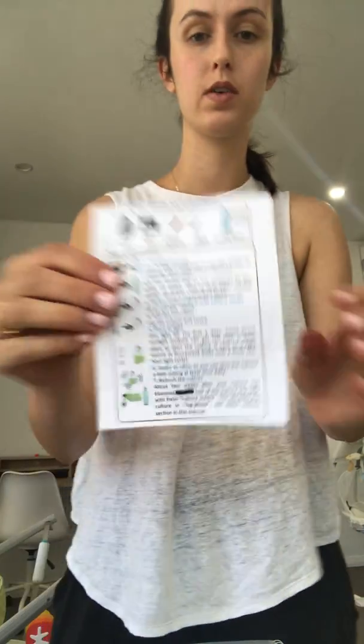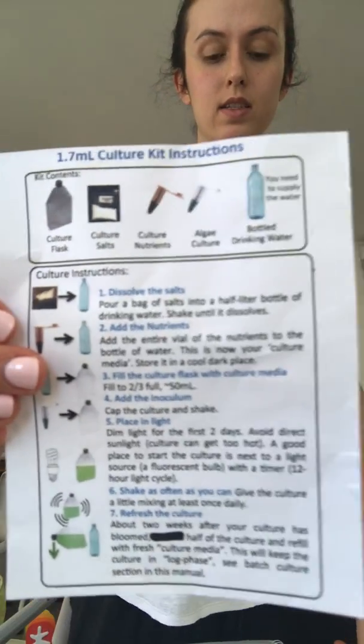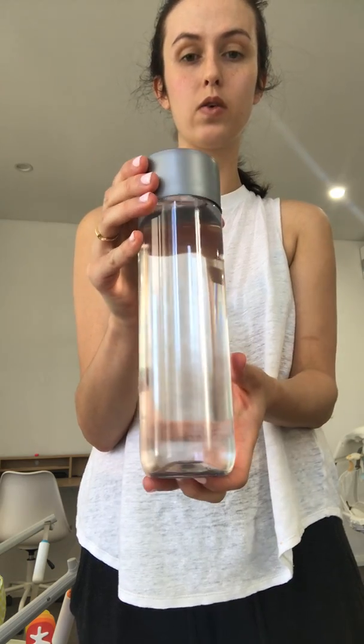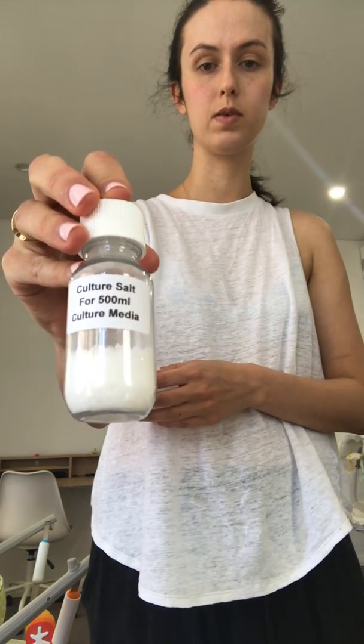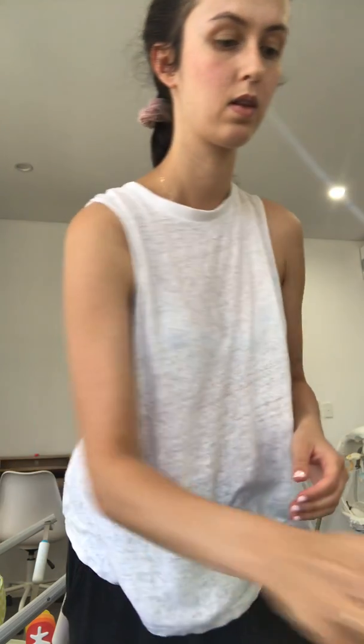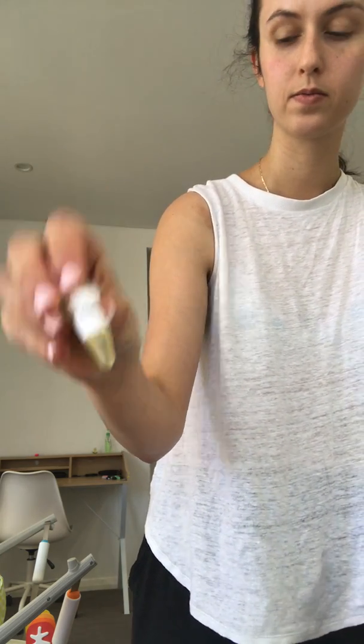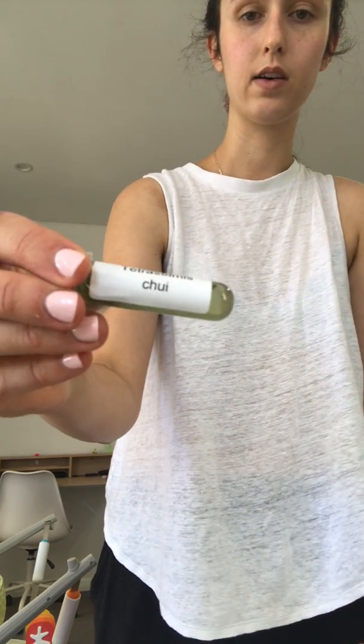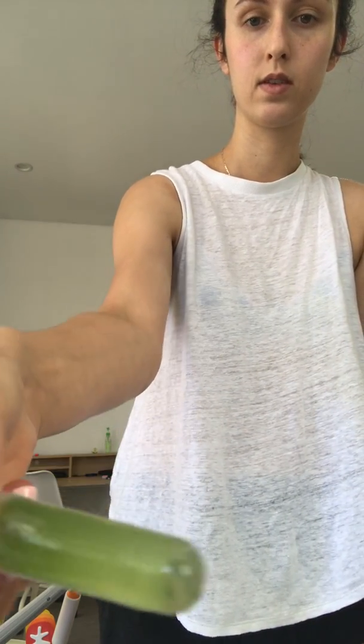These are the instructions that come with your culturing kit, and the five things we need to start off with are: 500 mils of bottled water that needs to be chlorine free, the culture salts for 500 mils, a flask which we'll be using to culture the algae, our culture nutrients, and finally our algae culture.